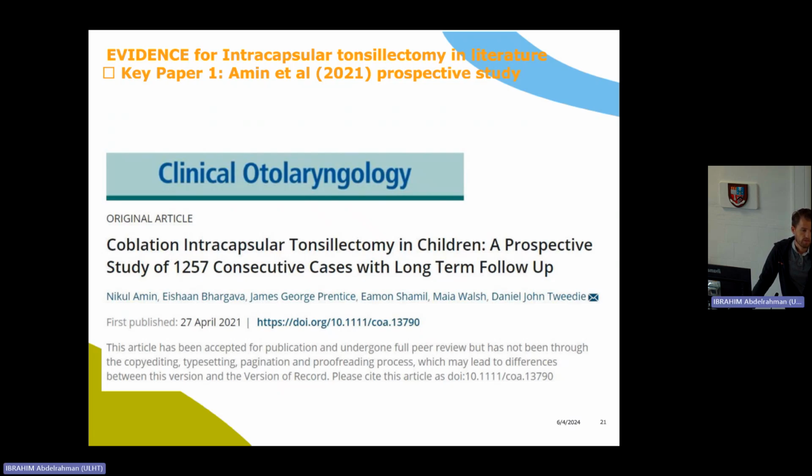with the suction. Same when you're using the coag and you're putting the energy onto the bleeding or onto the blood vessel, it oscillates and vibrates that blood vessel very quickly, so it shrinks and closes and seals the vessel. There's two different ways of it working. With the coag, you're using the energy straight onto the tissue to seal and oscillate the vessels and get them to close. But when you're using the ablation, it's very much a lighter touch. You're letting the plasma do the work to break the molecular bonds and suck it away. Yeah, that's the best I can answer, I'm afraid.